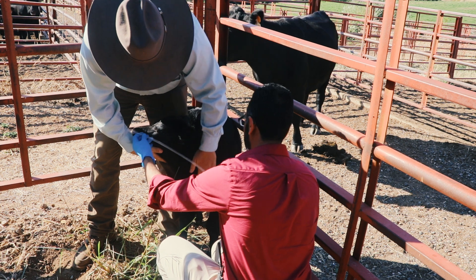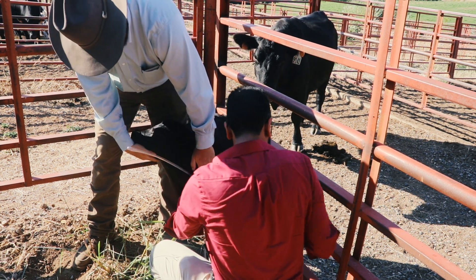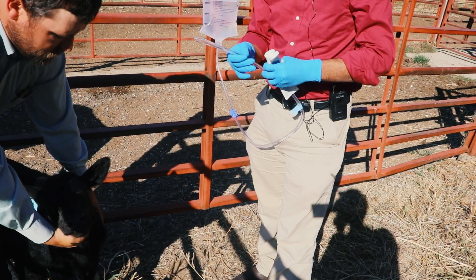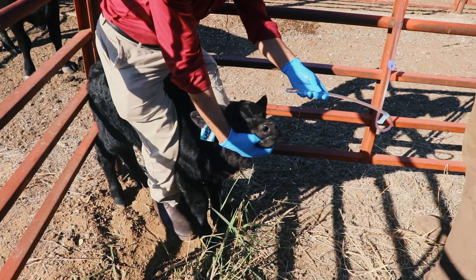Measure the tube from the mouth to the shoulder to check how far you should insert the tube. You can mark the spot with a piece of tape. It is also a good idea to apply a bit of lubrication to the tube so it is easier to insert.